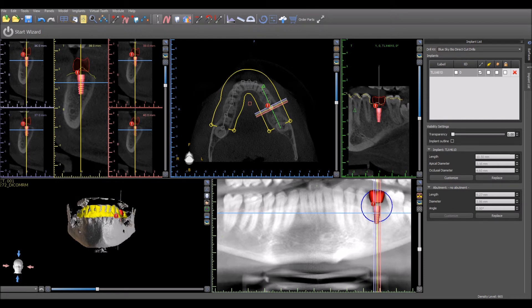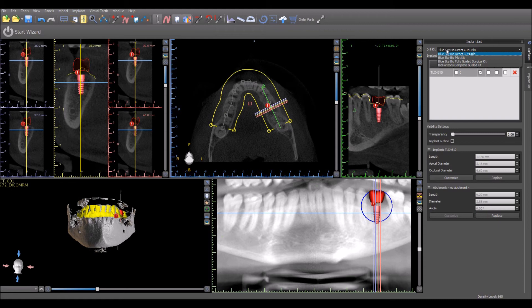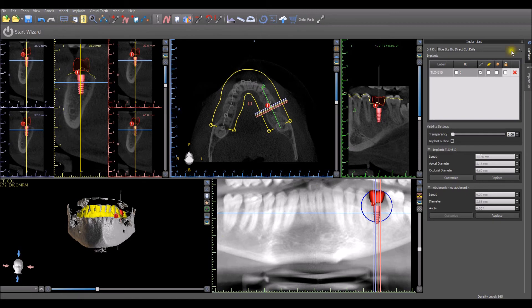In the implant panel, click the drill kit drop down menu to select from the relevant guided kits that can be used. The implant manufacturer's guided kit will be listed in the drop down menu.